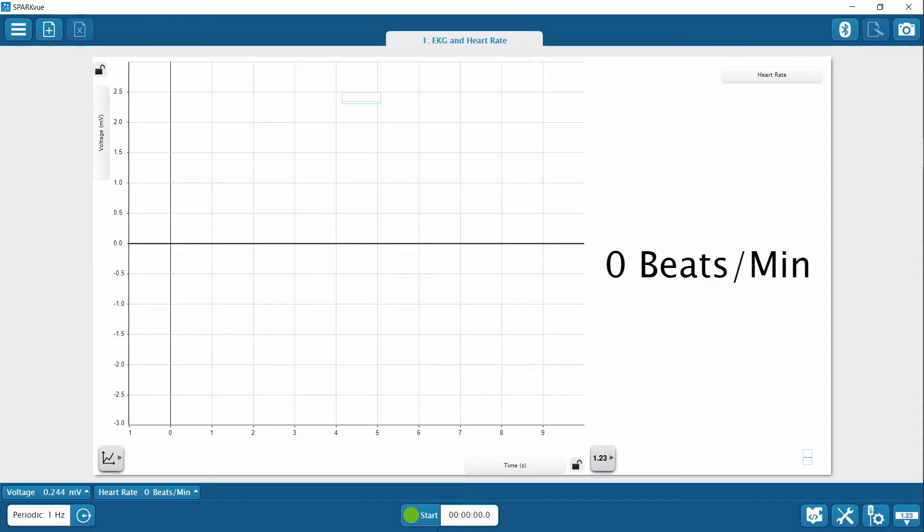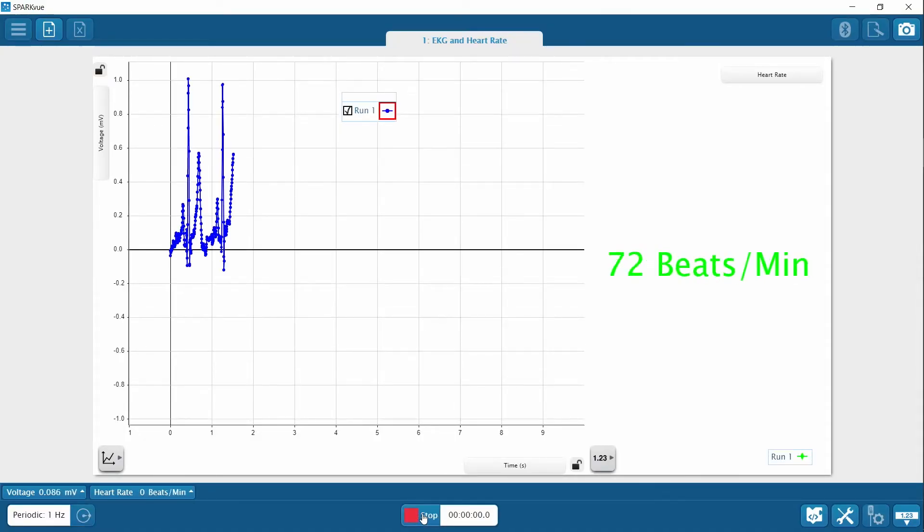Before starting data collection, I'm going to remind the test subject to stay still and silent and to not look at the data display while I'm recording data. I'm just going to collect a few seconds of data. And now I've stopped data collection. My test subject can now speak and interact as usual.